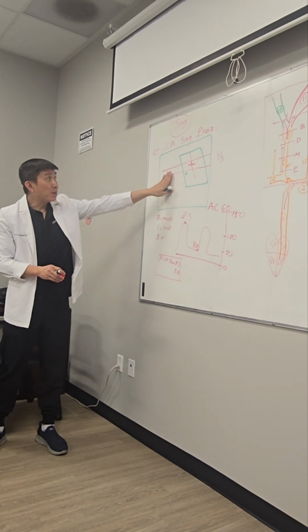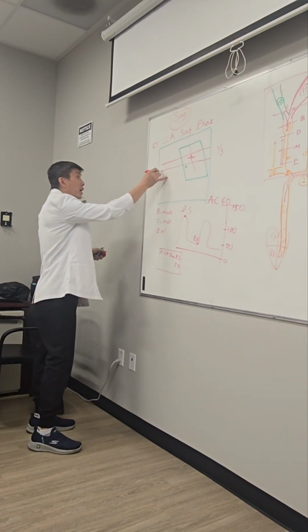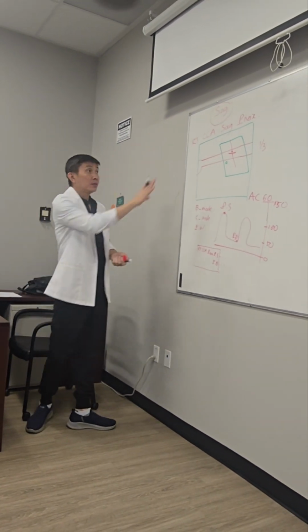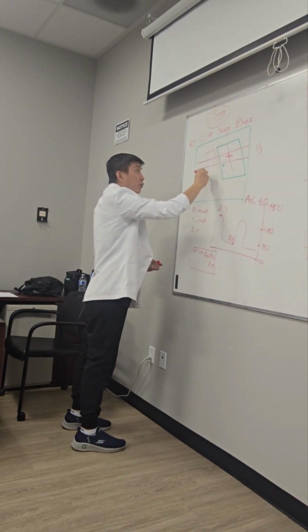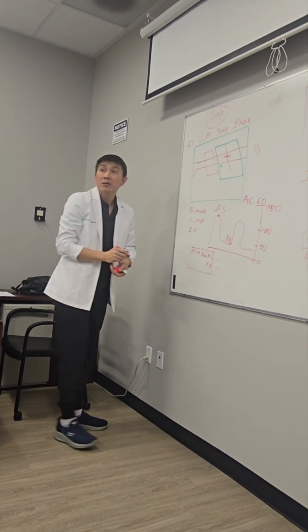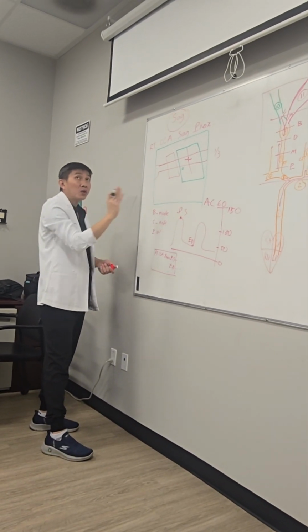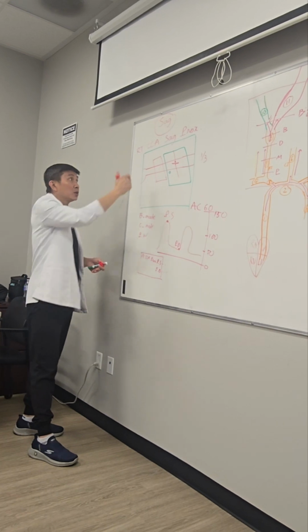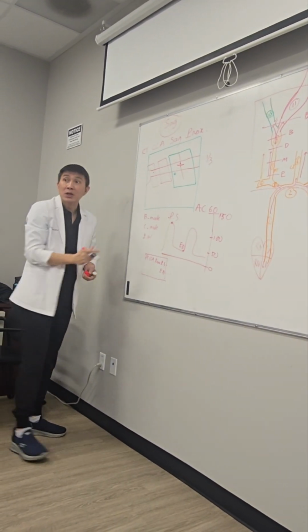Yeah, so we do the same for mid and distal. With the distal here, you're going to see both areas. So you have two options. You measure the proximal here. You do the same with the mid. And then for the distal here, you can angle or you can rock the transducer to get the box steered this way to get the distal in this position.